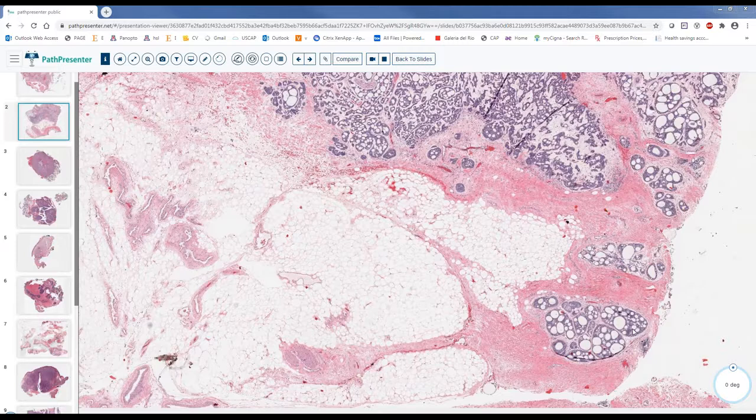Okay, so going back to my question, I want some answers other than Hina. Do you guys think this is a parenchymal invasion or not? Having that this is a salivary gland, and we see the tumor going through the fat. It's okay, just speak your mind.